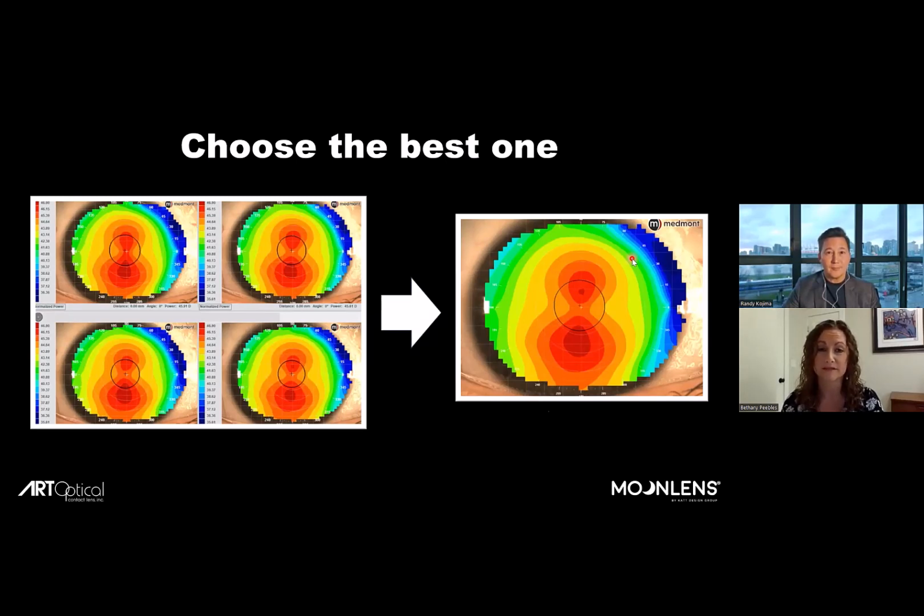So if our baseline is questionable at all, then unfortunately throughout the fitting process, as we do those comparison maps, those distorted mires, or the tear prism is too much, throwing things off, the lashes, all of that, unfortunately, are part of the fitting process the whole way through.